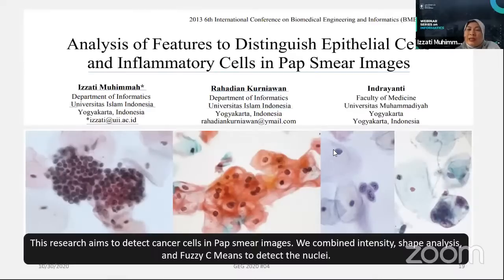Why do we need to count the cells in the pap smear image data? Because counting the number of cells is one of the quality assurance steps before the data can be reviewed for diagnosis. There is a requirement that in one slide there exist 4 types of cells.